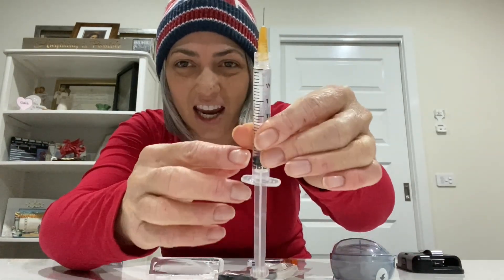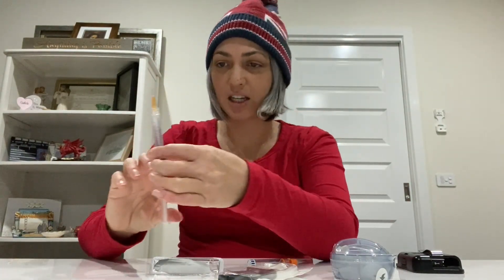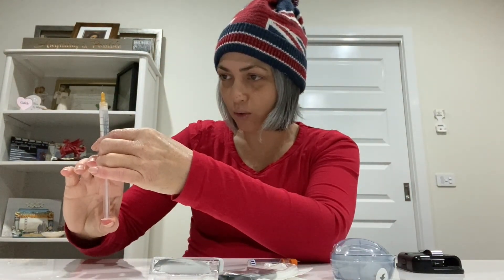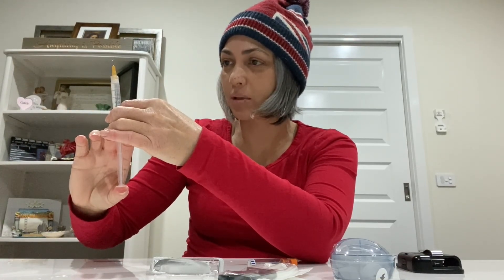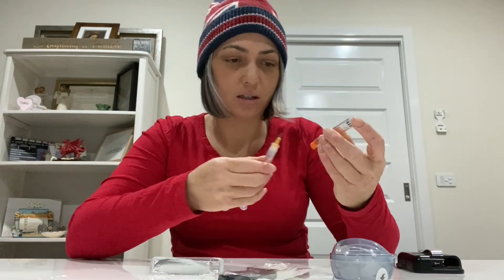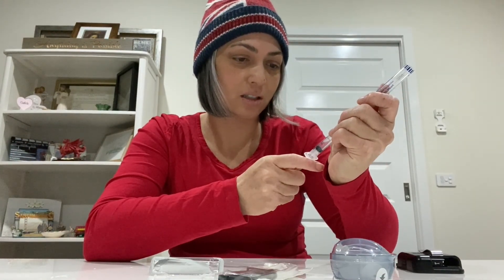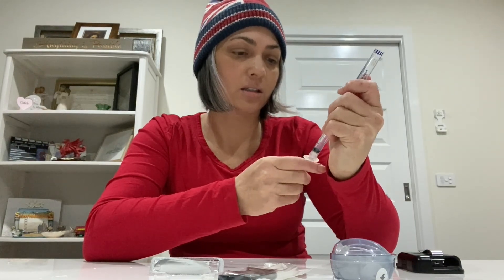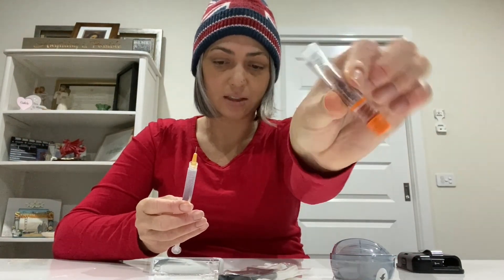There's usually air in there, so I have to flick it and squirt it out — this is always the fun part. Then just keep drawing the insulin. Okay, that insulin bottle is empty, so into the rubbish it goes.